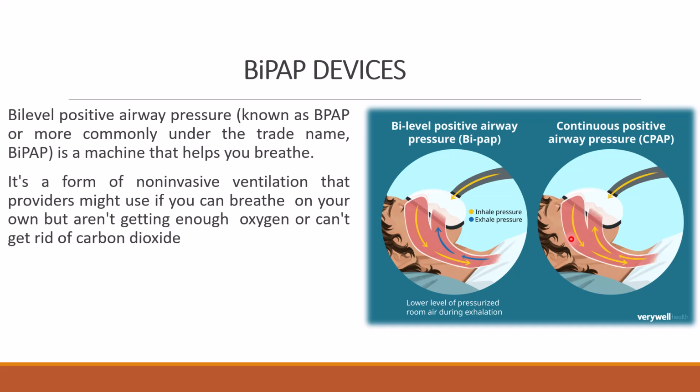We cannot determine anything or play with these controls without telling the doctor or without the doctor knowing.